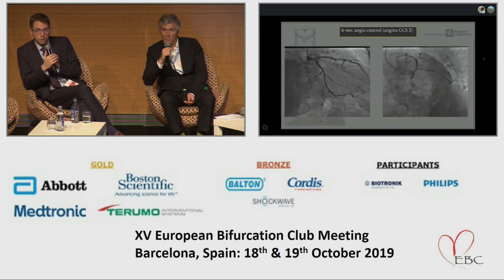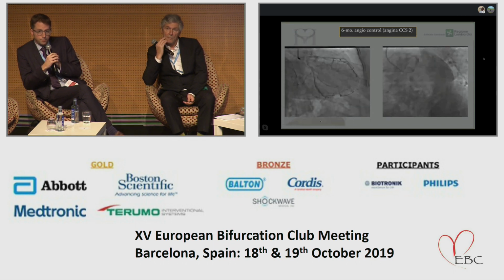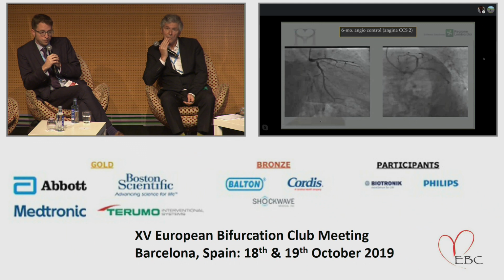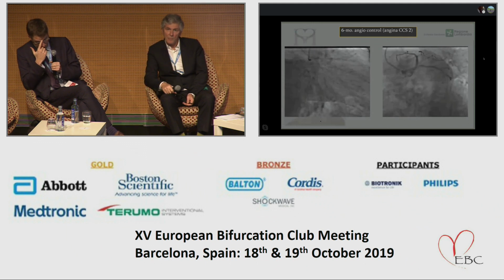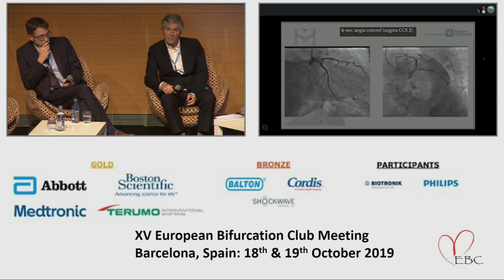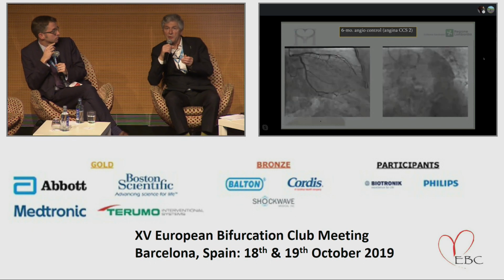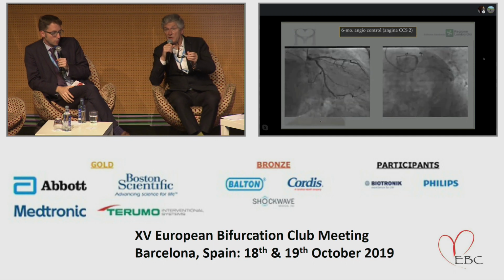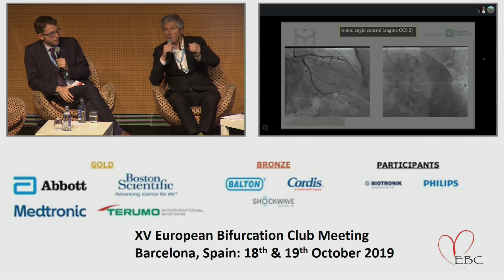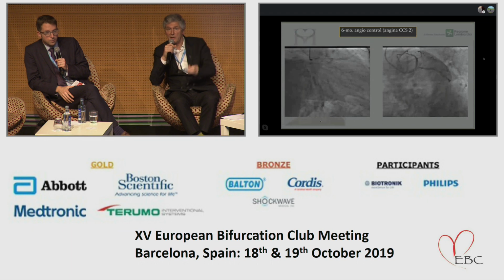So one question: was DK crush done? Did they do the kissing before the self-expanding stent? No, this is the reason, because they went directly without doing it. It was not DK. The purpose was not to do a DK crush, but a systematic T-stenting using a self-expandable stent. But there was probably too much protrusion.